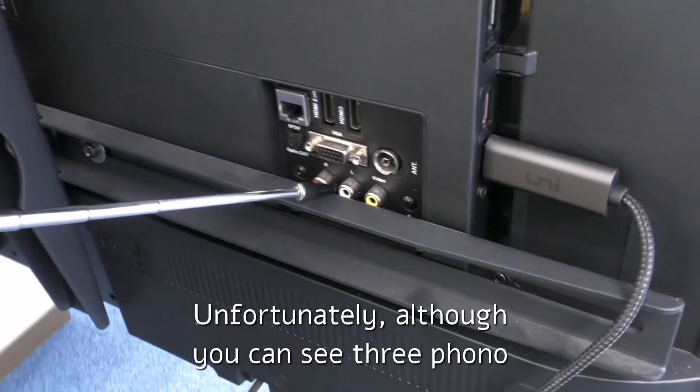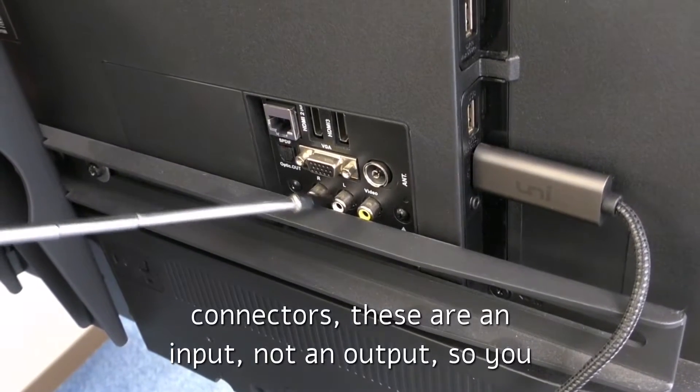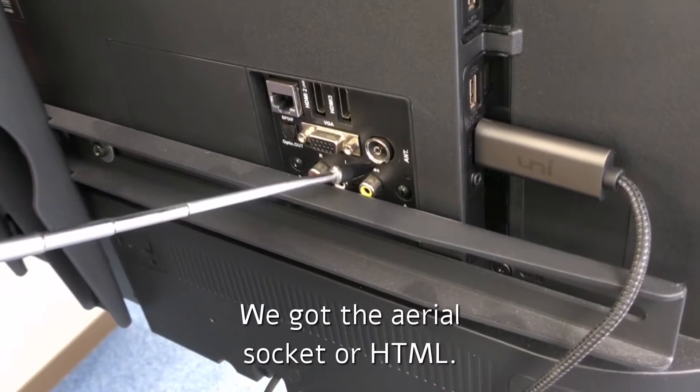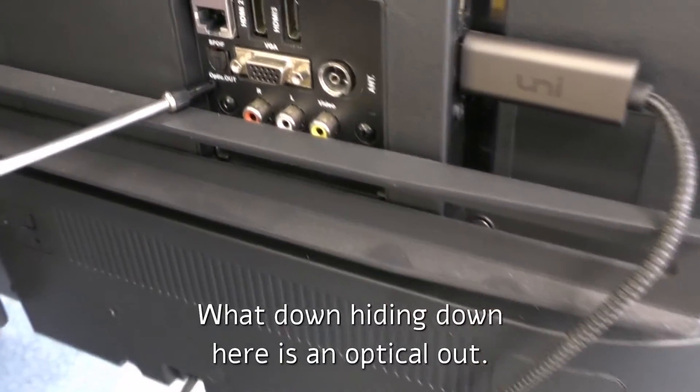Unfortunately, although you can see three phono connectors, these are an input, not an output, so you can't take the sound out of that. We've got the aerial socket, we've got HDMI, but what's hiding down here is an optical out.